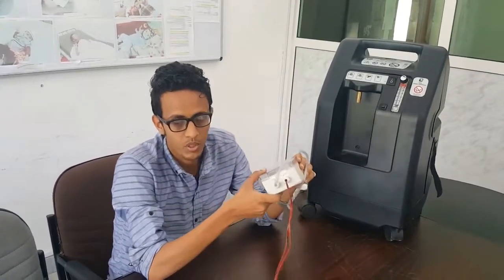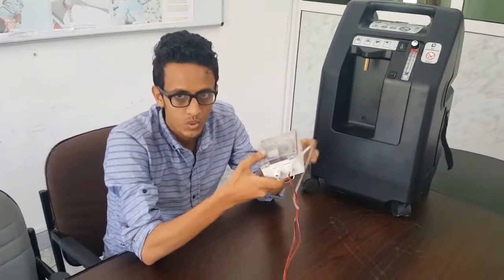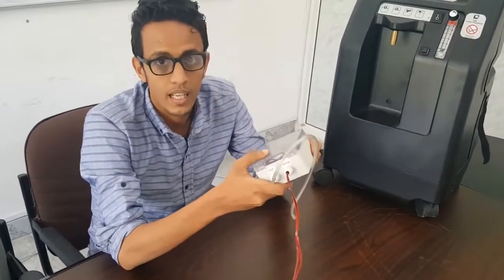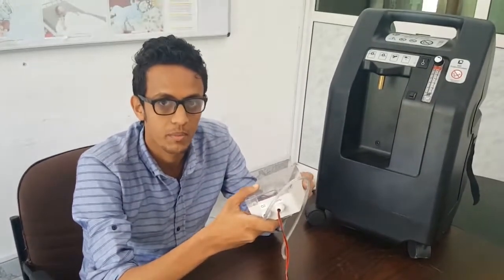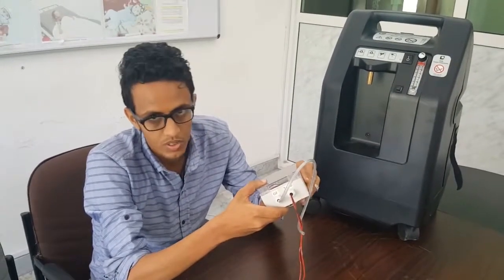That means we will be able to check and monitor the performance of the device online through Wi-Fi. This is the Internet of Things box. It includes an ESP32, an oxygen sensor, an LM35 temperature sensor, and a real-time clock — RTC.